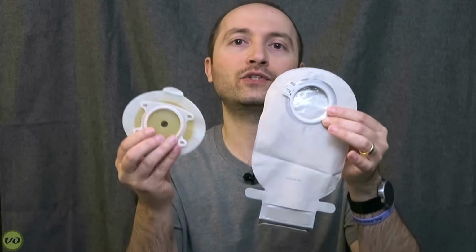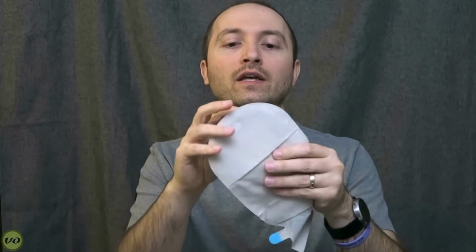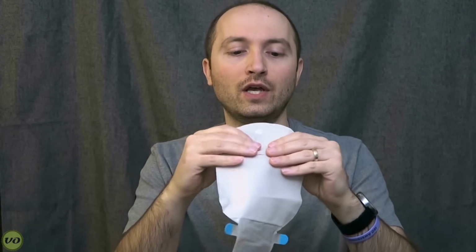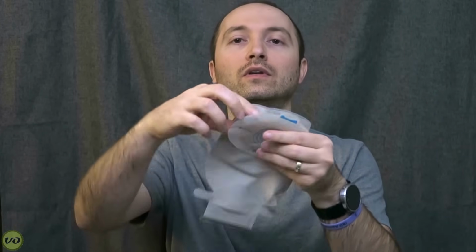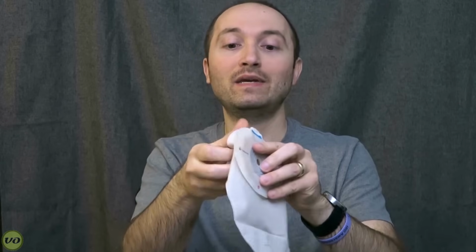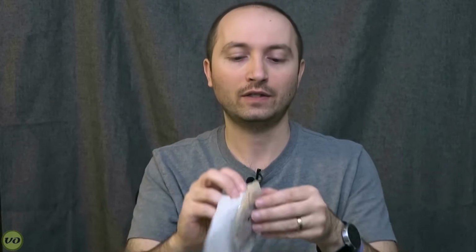And on the Coloplast two-piece system, they actually have a locking mechanism. So when you combine the wafer and the pouch, you can actually snap this little lock closed. And that basically means this is not going to separate anymore. It is foolproof, and it doesn't matter how much weight you have on there. The only thing it's going to be tugging on is the base plate part, the wafer part, and that's why they put the belt tabs there. Now, both of these products are examples of mechanical couplings.